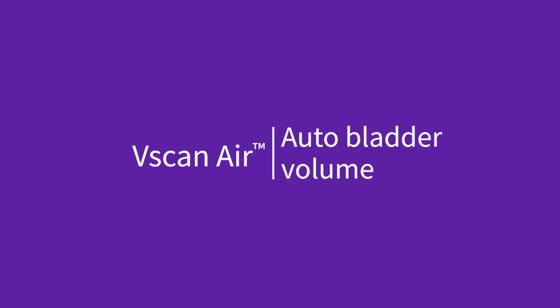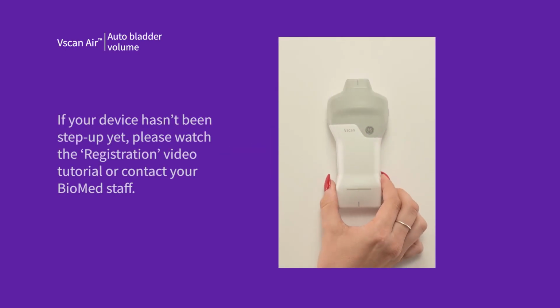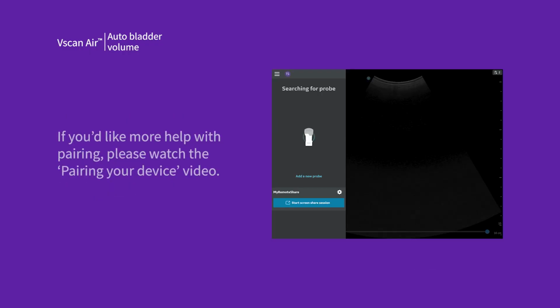In this video, you'll learn how to operate Auto Bladder Volume. We will start by turning on the Vscan Air probe by pressing and holding the button for 2 seconds. Next, pair the probe with the Vscan Air app.